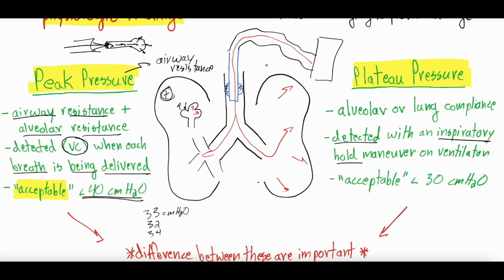So just picture it. It's essentially if you took your own breath in, and then you just held it in your lungs. You're not letting any air in, you're not letting any air out. But you can almost feel the pressure in your chest when you do that, right? Because your lungs are inflated, and your lungs are tissue. So as the air is pushing those lungs out, the lungs are also pushing back in. They're trying to deflate back down. And if you're not letting any of that air escape, the plateau pressure is the pressure that the vent is feeling as those lungs try to deflate when we won't let them.